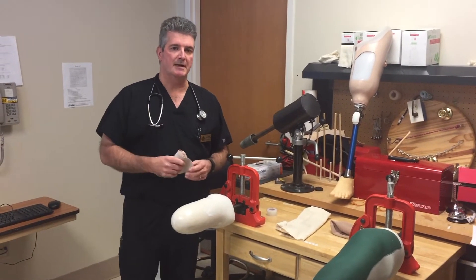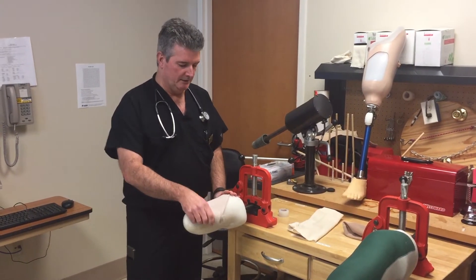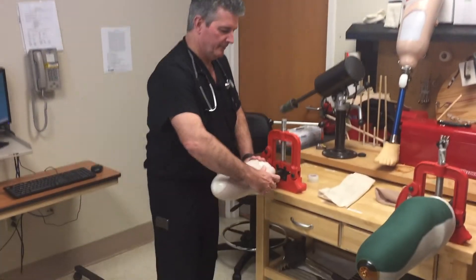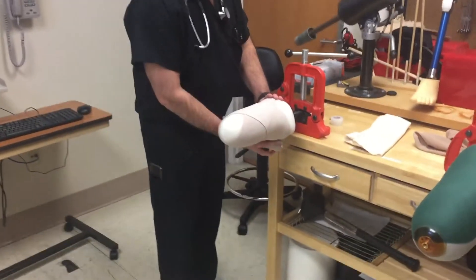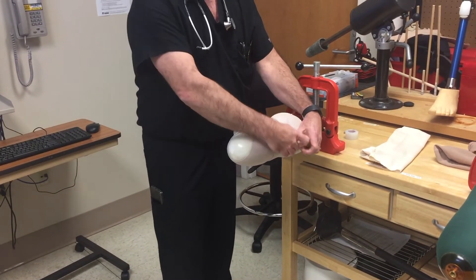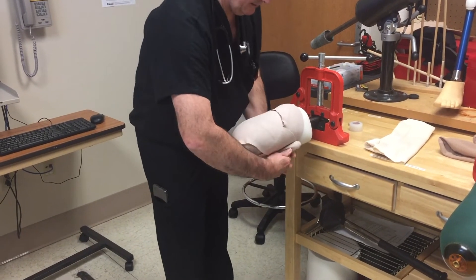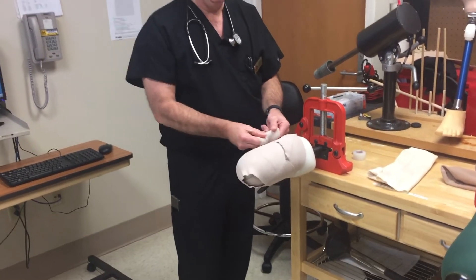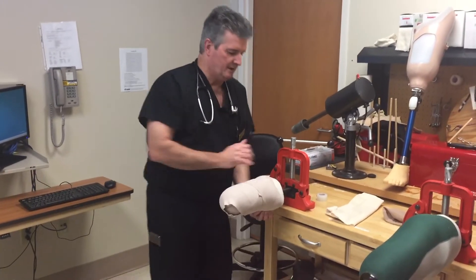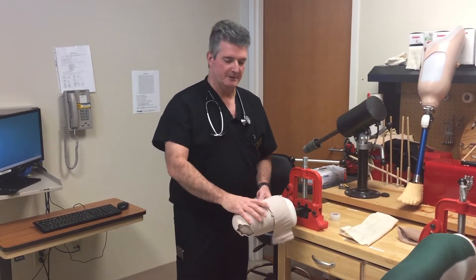Our patients tend to like using tuba grip better because it doesn't take as much time. When you're doing a stump ACE wrap you use a figure eight, and you always want to make sure that when going horizontal across the limb you're at the knee joint, below it, or above it. This is how you do an ACE wrap — you tape it and it stays on the limb. It's not the prettiest but that's a quick example.